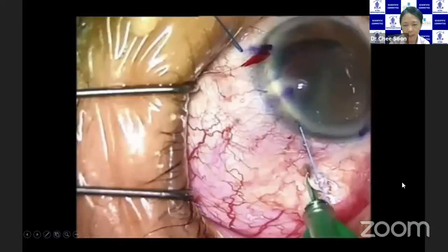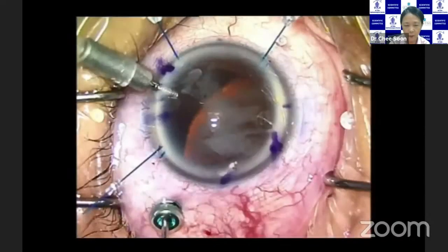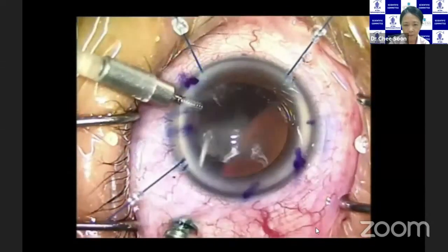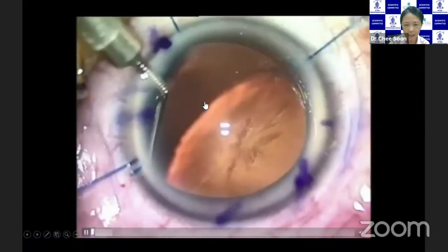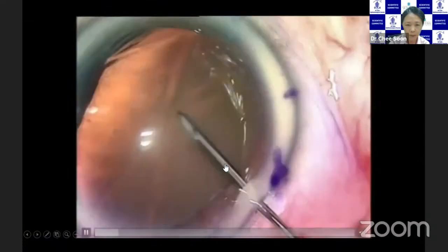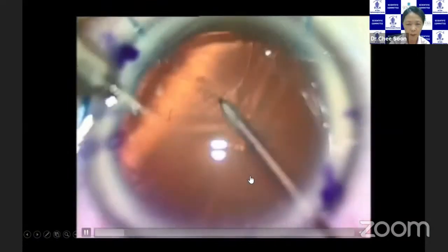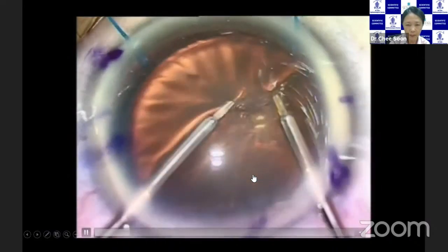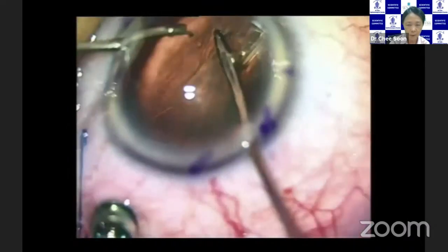This is the final case I'm going to show you. It's a difficult case. You can see less than 180 degrees of zonulysis. We start with vitrectomy because there's vitreous line in front of this lens that is dipping posteriorly. Right? You want to remove adequate but not too much because it does support the lens. This vitreous behind does support the lens. And with the 27 gauge needle bringing this lens forwards, I then catch it at where the capsule was slit.